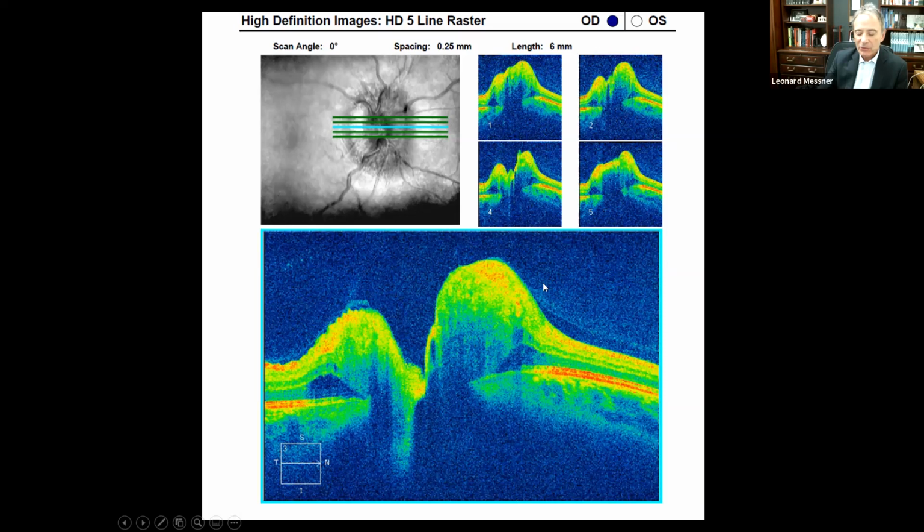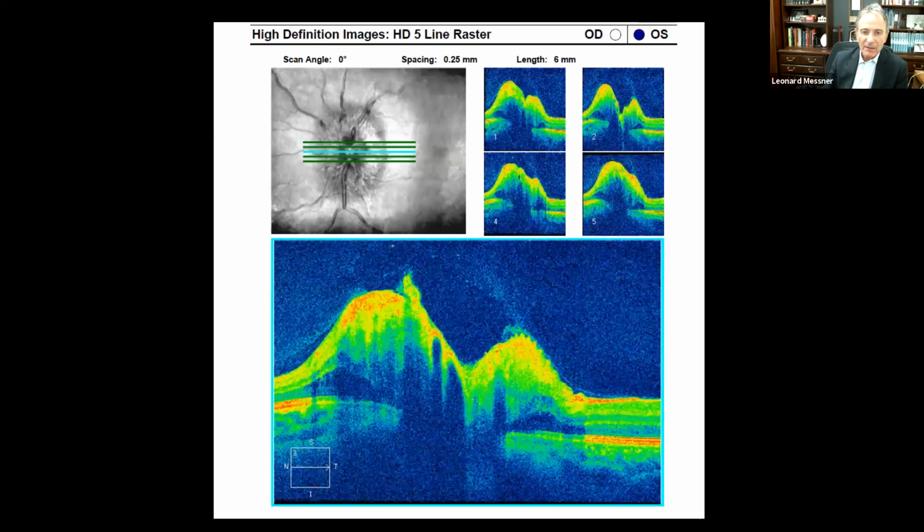the inner retinal layers. And in the left eye, very, very similar findings: elevated optic disc, preservation of the central cup, inward deflection of the RPE Bruch's complex, a bit more so on the nasal side than on the temporal side, this recumbent or inverted V pattern or lazy V pattern, and then also this folding to the retina that is evident, the inner layers of the retina on the temporal side of the optic nerve.